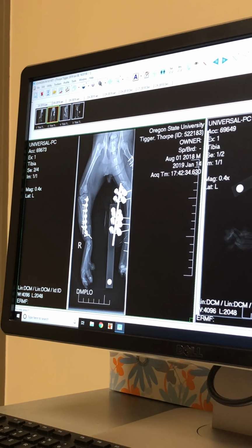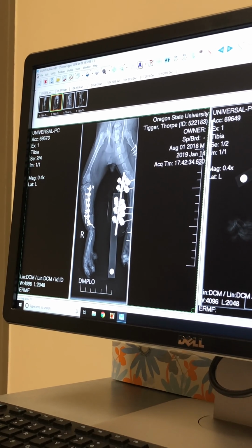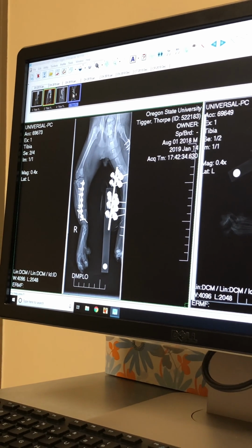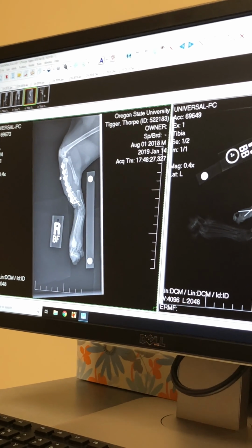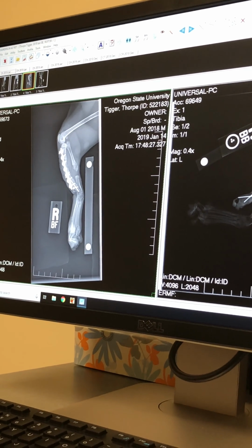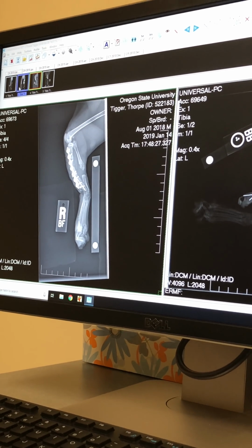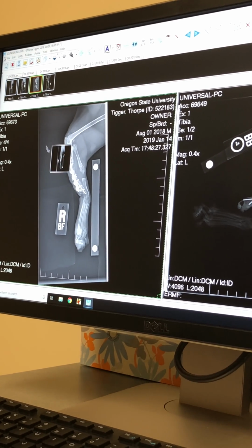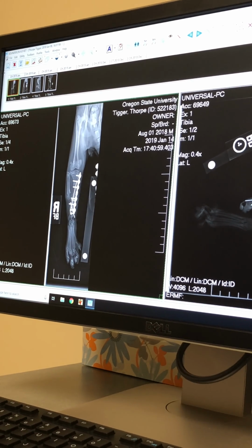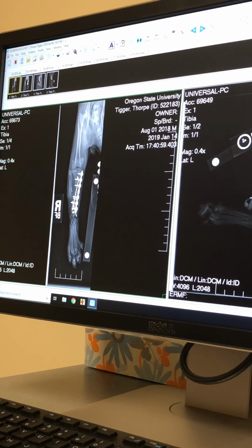So this kind of funny looking device here is called string of pearls, because it looks like a pearl necklace. That's the type of plate it is. And let me pull it up over here. So now this is under the skin. There's nothing sticking out, no external fixator. So he's got a really strong plate, and then you can see, let me pull it up over here, it's going to be better. There's also a little pin through the middle of the bone to help with bending forces.